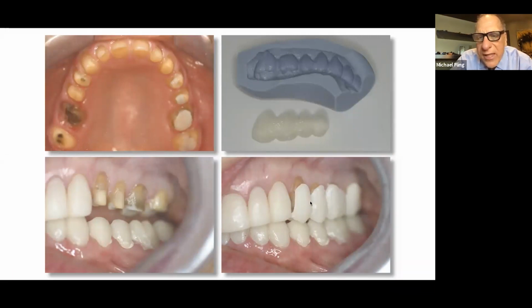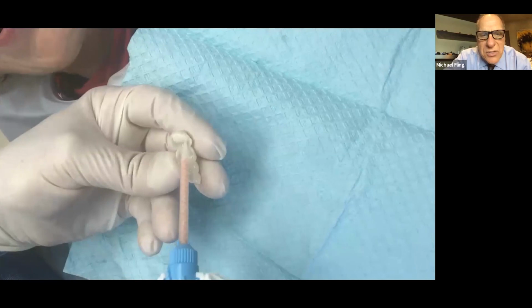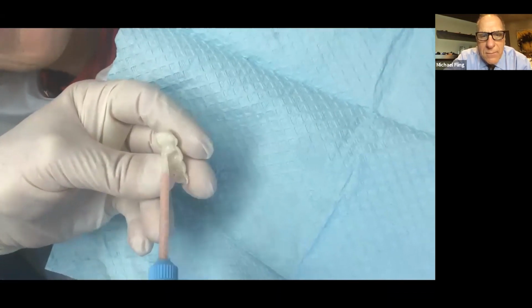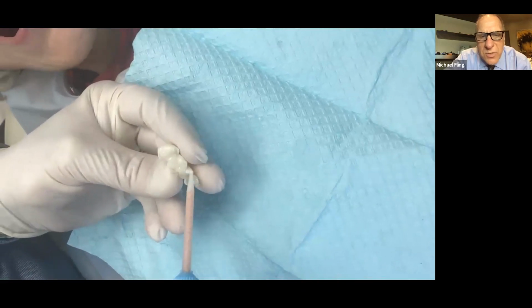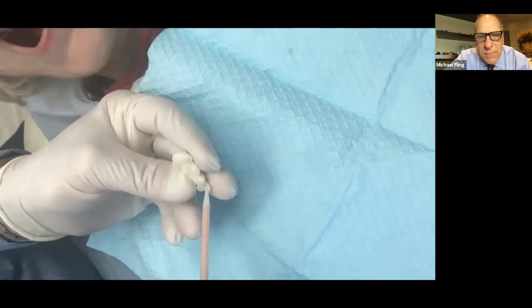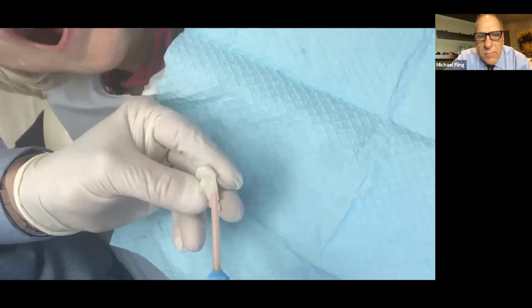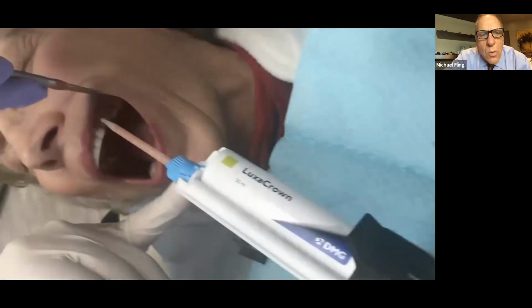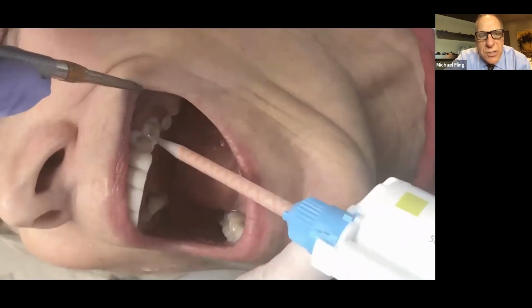I'm going to fill this with more bisacryl. And because this is a shell, I can fill it with more bisacryl like you see here. This was Luxa Crown that I was using. And now I'm going to go around the teeth and put it around the margins.